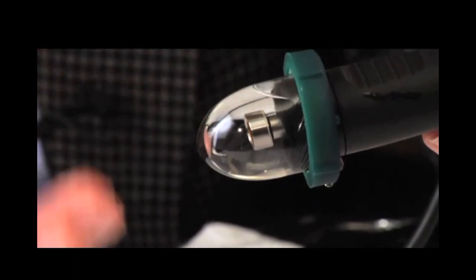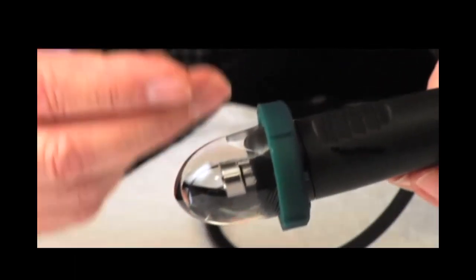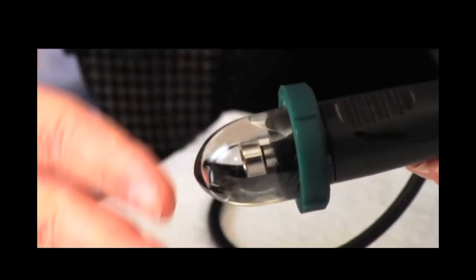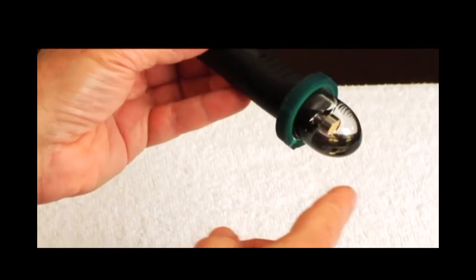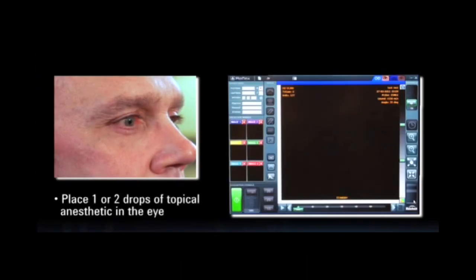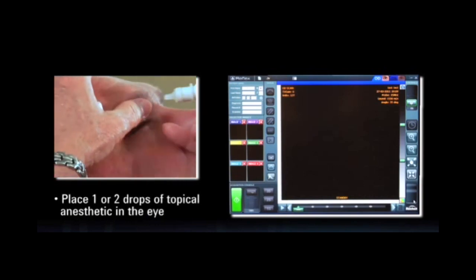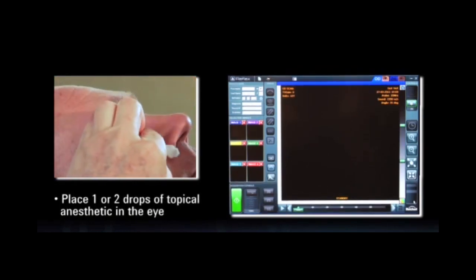And in fact, you might want to have as little pressure as possible in an eye that has 2 or 3 millimeters of mercury. It would appear very wrinkled and also flaccid, sort of moving downward here. And we're ready for the exam. I've maintained the conical bullet shape, which is imperative, to put 1 or 2 drops of topical anesthetic into the eye. Look up for me. We're going to give that a few seconds to work.